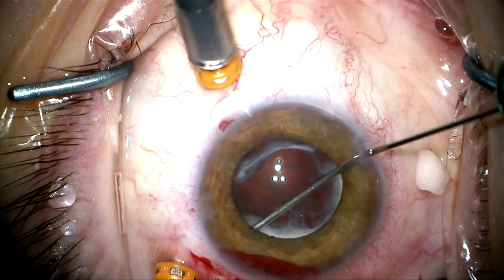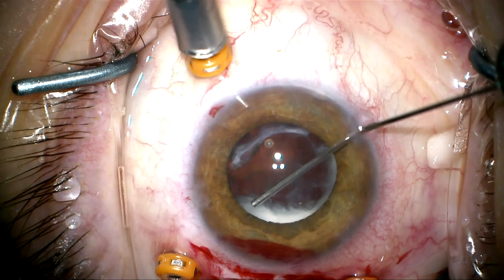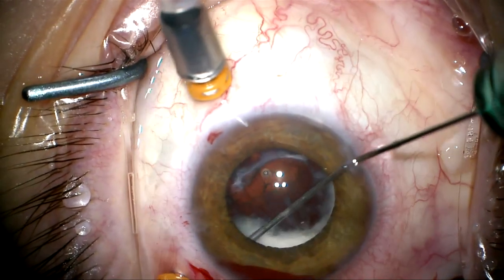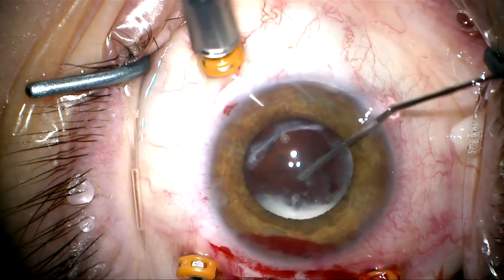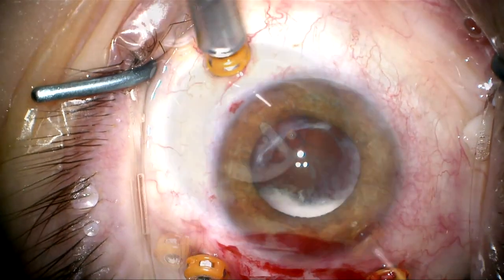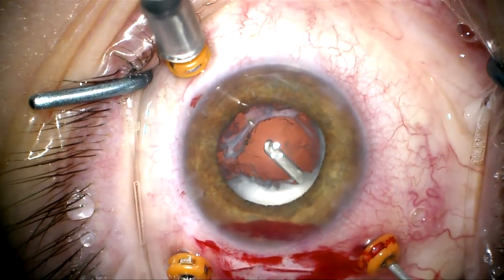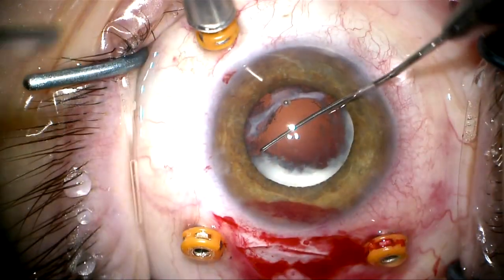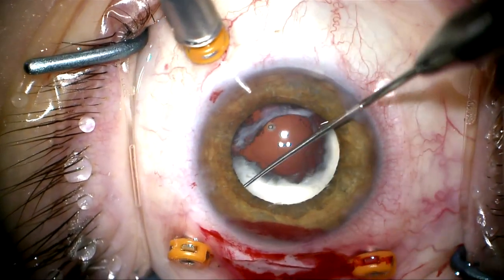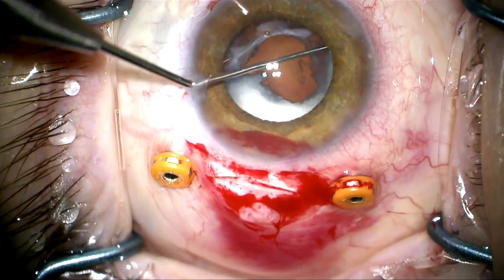This side is even more socked in and I want to be careful not to strip the remaining zonules. I'm going to use cohesive viscoelastic to visco-dissect the Soemmering's ring segment here, which is quite large. I can feel it starting to loosen up. I'm going to clean up with the vitrector to make sure there's no adherent vitreous. I'm now going to take a Sinski hook, go under the anterior capsule, and pull this large Soemmering's ring segment out of the recess of the capsular bag fornix.